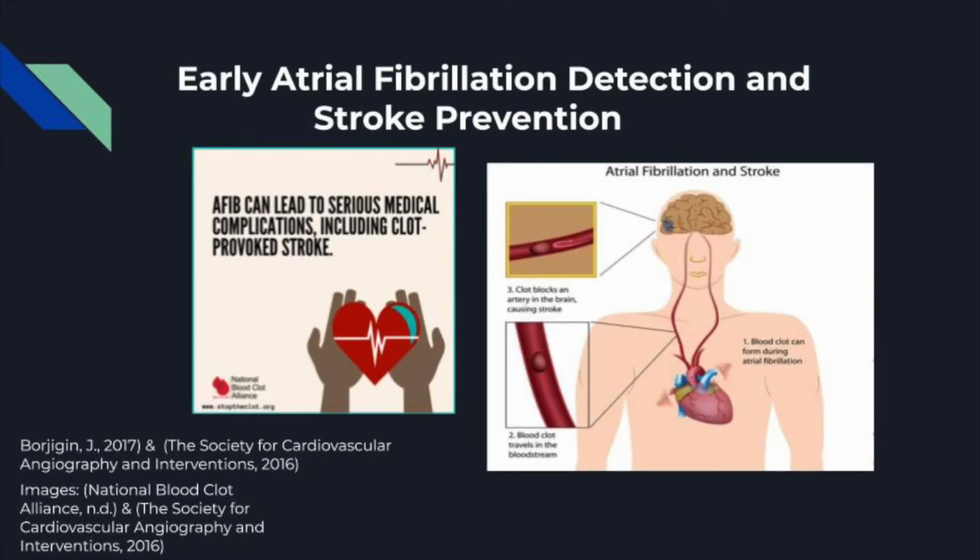Now that we know the differences between an electrocardiomatrix and an electrocardiogram, let's get into the practicality of the electrocardiomatrix. With the early detection of conditions like atrial fibrillation, the new and upcoming device will reduce many strokes annually. Strokes can be caused by atrial fibrillation, as the heart's irregular rhythm can cause blood to collect in the heart's upper chambers, the atria, and clot.